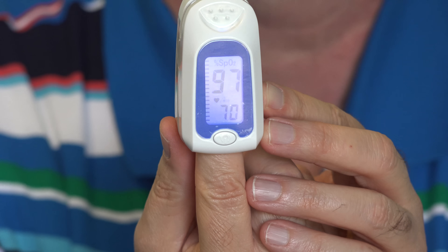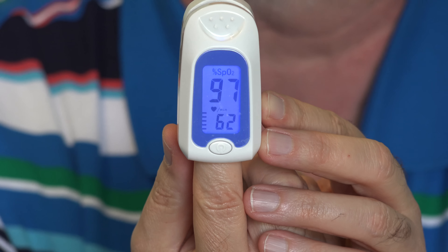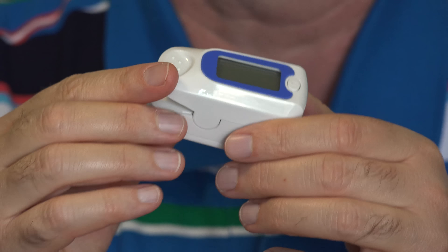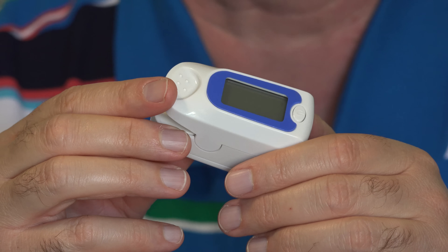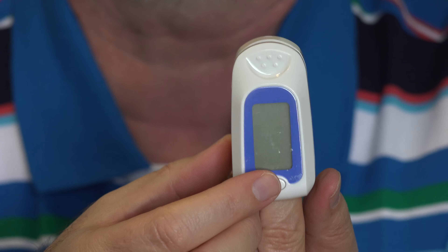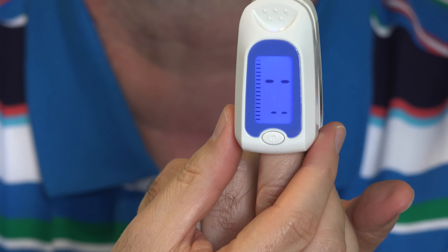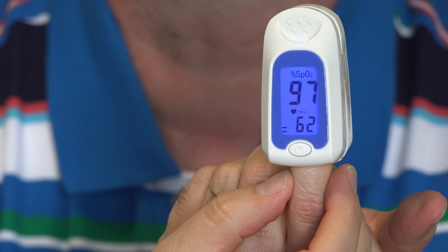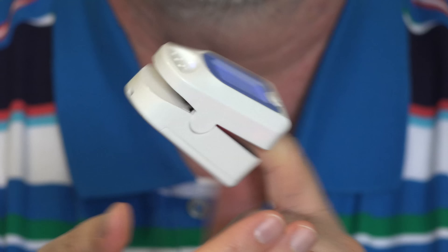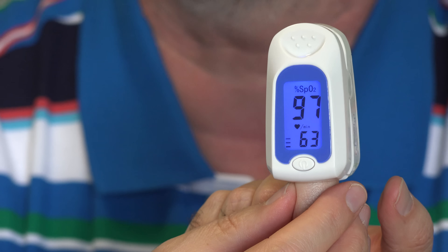I'll do the clothespin, get my finger all the way in there, and then hit the power button for the first reading. Looks like 98%, 97% — that's still pretty good. Anywhere above 95% and you're probably pretty healthy. And my pulse is 62 — that sounds about right. I'll try it on the finger of my other hand, which you'd think would be the same blood saturation. So it should be around 97. There we go — 97, even 99, settling at 97. And a pulse of 62. Pretty good accuracy — right hand, left hand, same numbers.